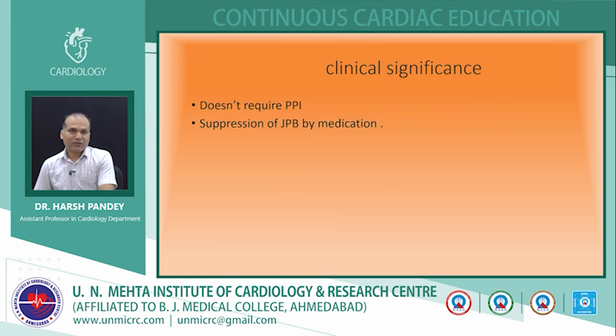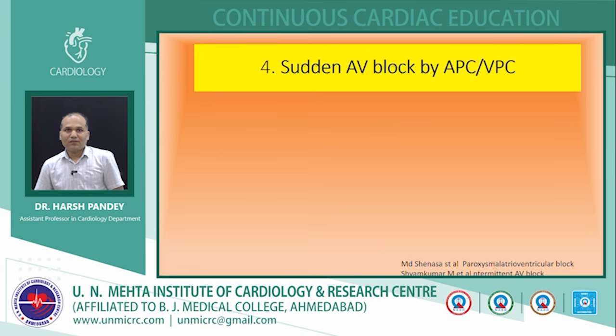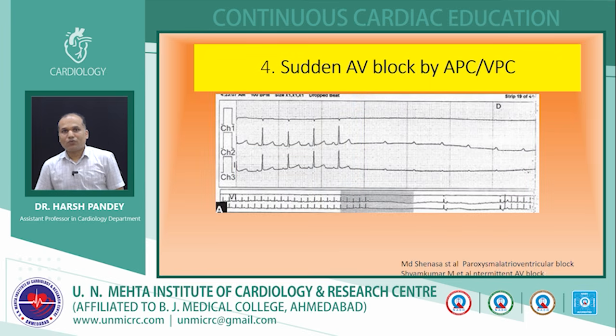Clinical significance: they usually do not require any pacemaker and are usually suppressed by medications. Then the fourth thing is a sudden AV block by an APC or VPC. So what is happening here? You can see there is 1:1 conduction, then suddenly all the P waves are blocked.